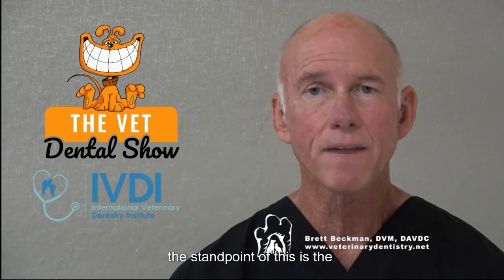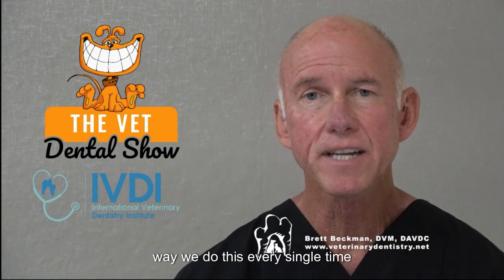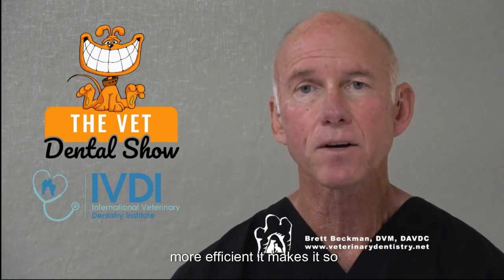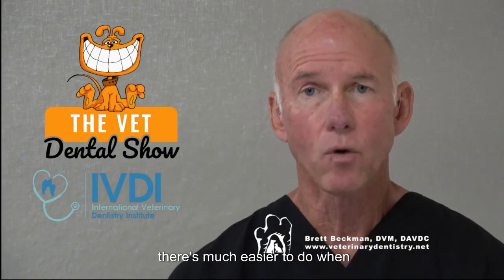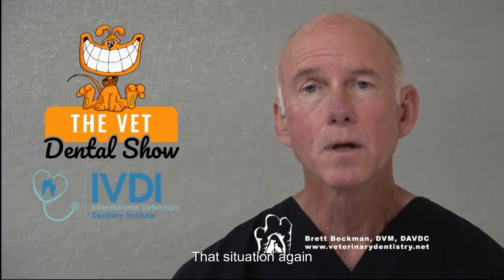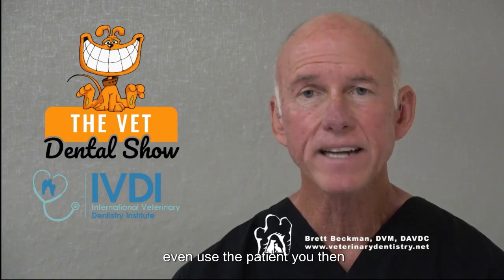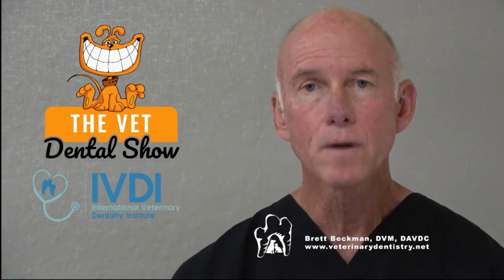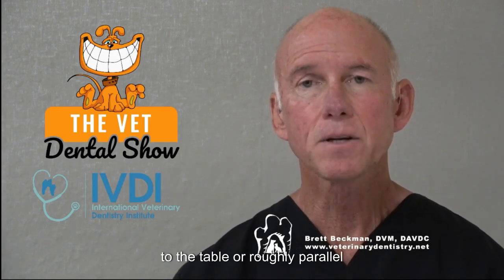You want to approach it from the standpoint of, this is the way we do this every single time without fail. And the reason is because it's more efficient. It makes it so that it's much easier to do when you are in that situation. Again, you don't have to make a decision. You've induced the patient. You then go to placing a towel under the chin to make that palate parallel to the table, or roughly parallel.